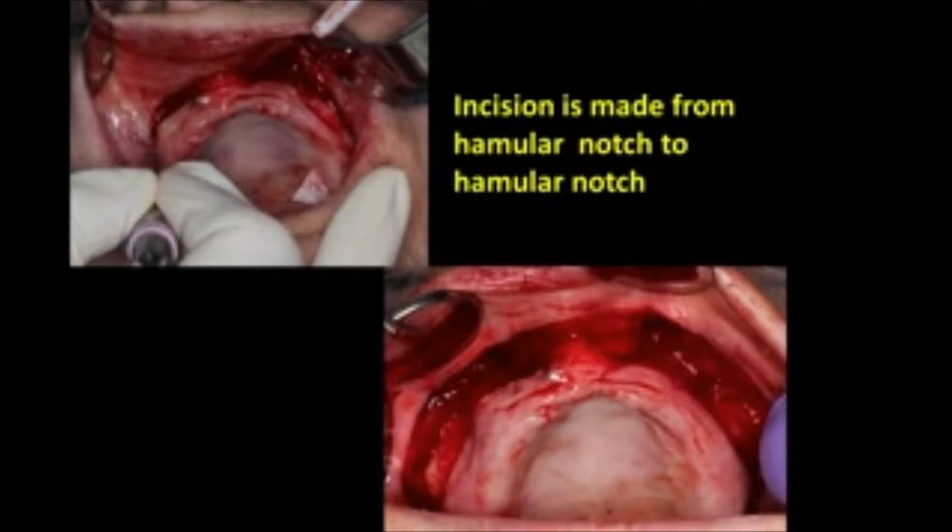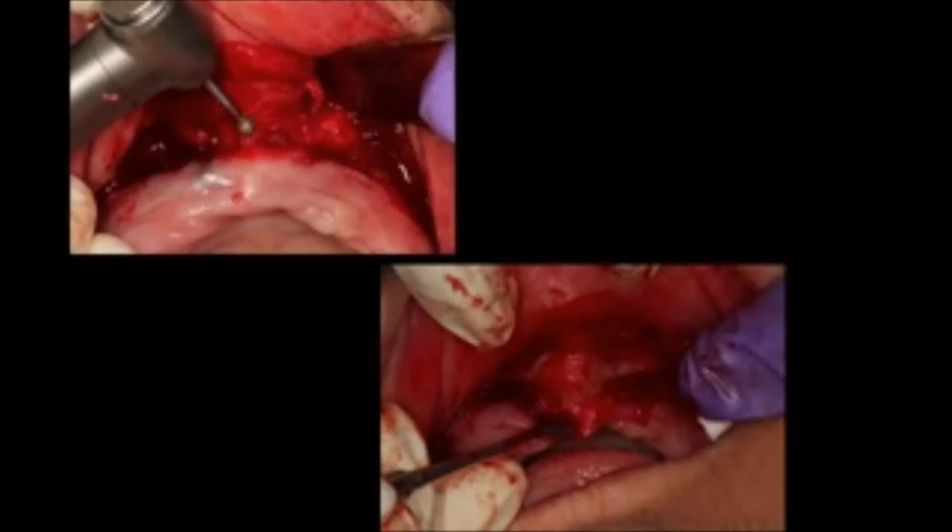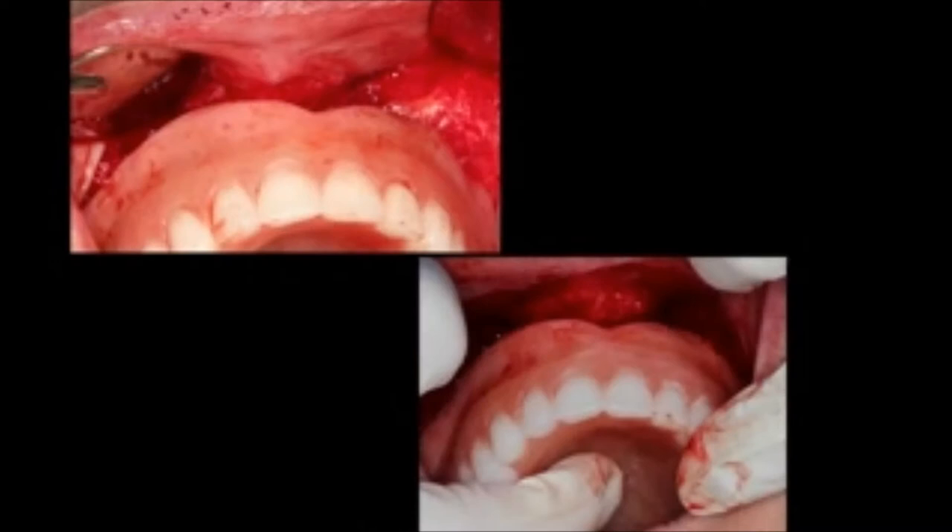It goes from hamular notch to hamular notch and is now almost ready to try in the denture. But what we want to do is work in the maxillary nasal spine area. Here we're using a diamond bur to do an osteoplasty to remove the nasal spine, so we can actually deepen the vestibule in that area as well.